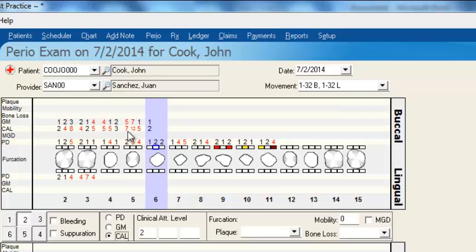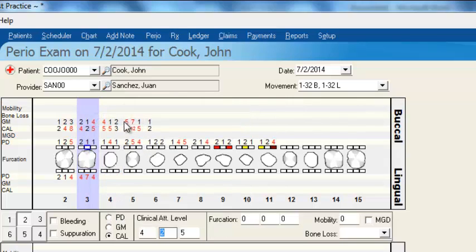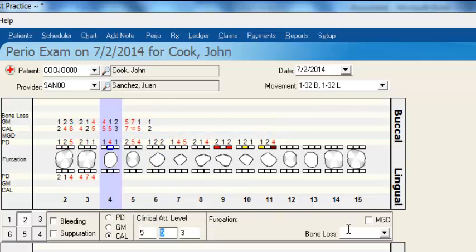If you're not using all these measurements, you can declutter your screen. If I right-click in here, it shows all the different things you can record. Maybe I don't want to record plaque level — right-click again — maybe I don't want mobility either. By deselecting these items, you can see they disappear from the screen.